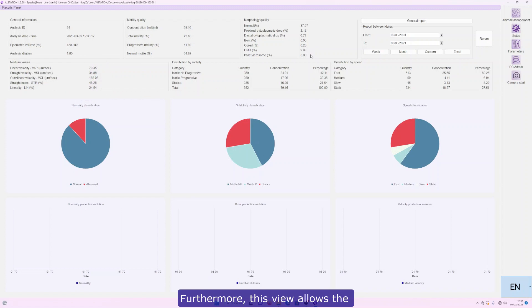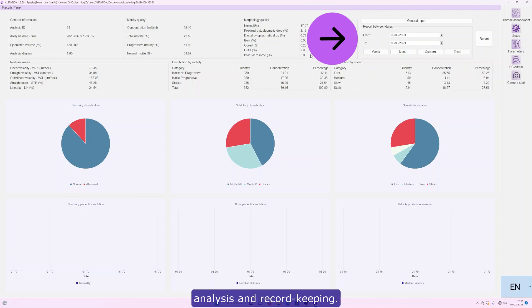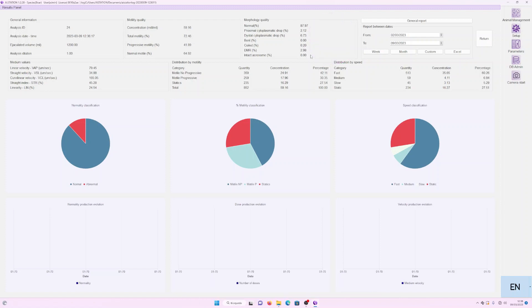Furthermore, this view allows the generation of different types of reports in Excel and PDF formats for further analysis and record keeping.